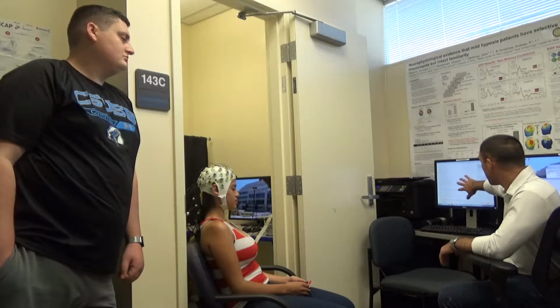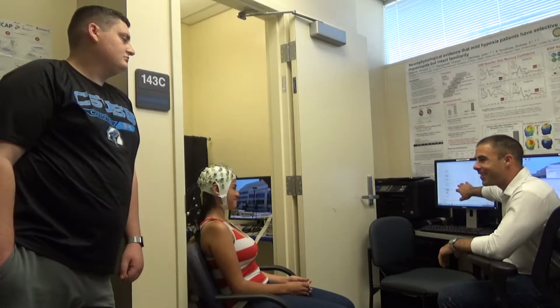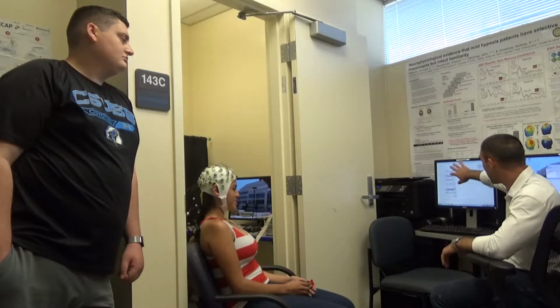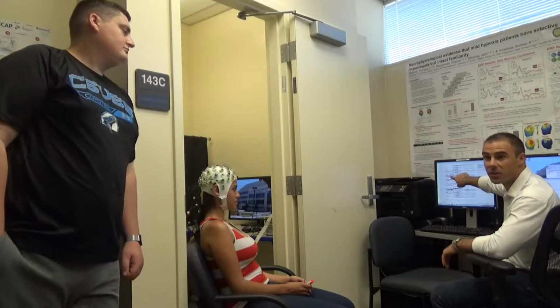And indeed when you do clinical EEG recordings and sleep studies and other things like that, you'll see that there are differences in those oscillatory spectrum activities based on the different REM stages of sleep. So we can see that here, but let's awaken our participant. She opens her eyes, and right off the bat we see all this stuff start to happen. First thing we see is all these big positive deflections.